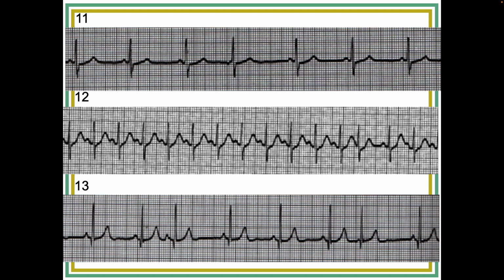Okay, next one, Chris. So this is sinus tach, sitting around 140-ish. Good. Okay, nice. And then it's going to be a premature beat as well, right here. Excellent. Nice job. Okay, now notice in this one, I know that if I were just to glance at it, I'd just say sinus tach, nothing funny happening. So you really have to go through. And if you're actually taking your calipers and going through, oh, this one comes in early. Okay, so good job.